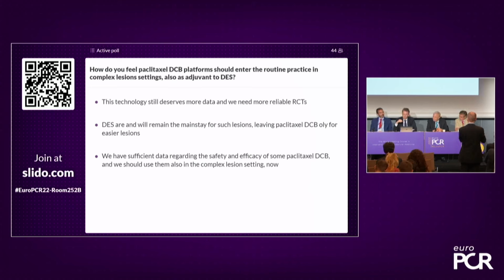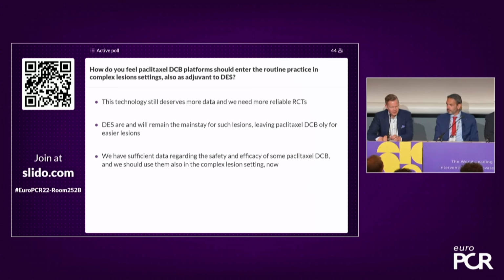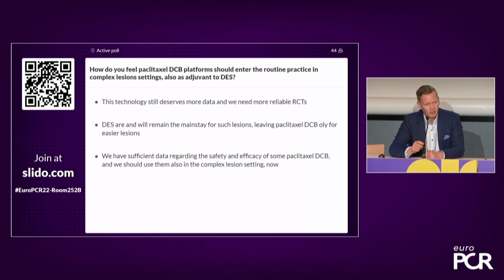Yeah, thanks very much. Well noted. Tuomas, you have a comment there? Yeah, we cannot take the patients back on a routine basis. In my practice, I would have finished the case in the first setting. I would have stented the part where there was a subintimal course of the wire, and then treated diffuse disease in the periphery with DCB. That's my practice in CTO. So you are correct that we cannot have control angios for every patient.